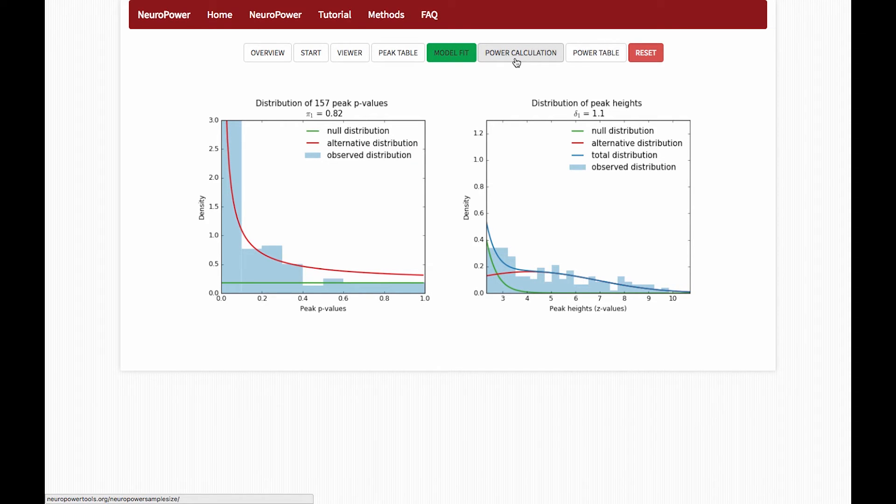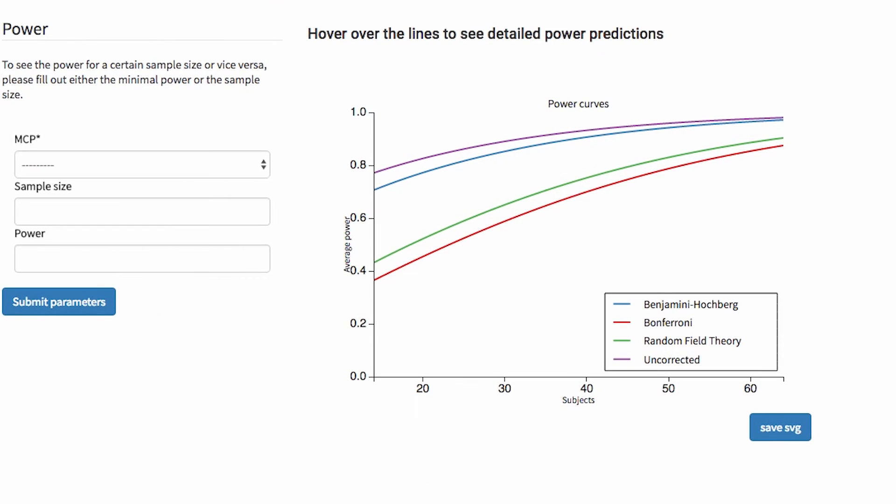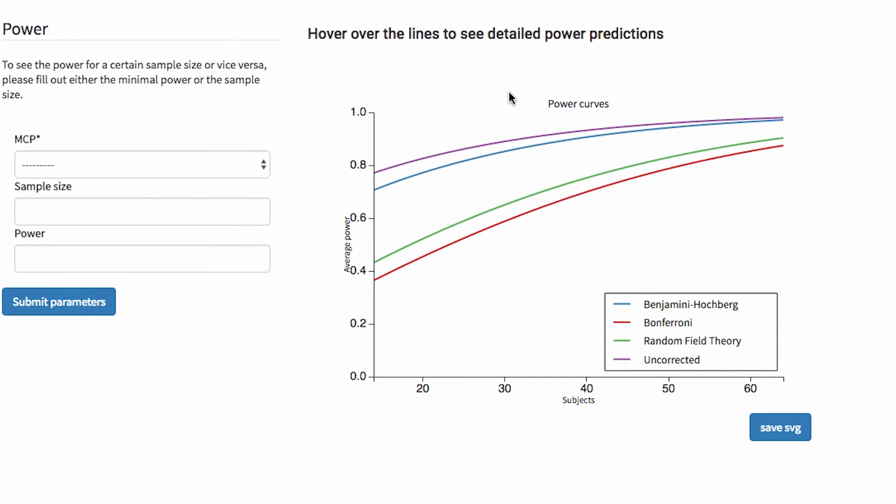Lastly, the power calculation is what you're most interested in, and this will generate power curves to show you what sample size you'll need for a certain power. So, in this case, we see different kinds of corrections. In purple, there's uncorrected. In blue, there's some other correction mechanisms I've never heard about. It's probably pretty cool though. And in green is random field theory, in addition to Bonferroni in red.